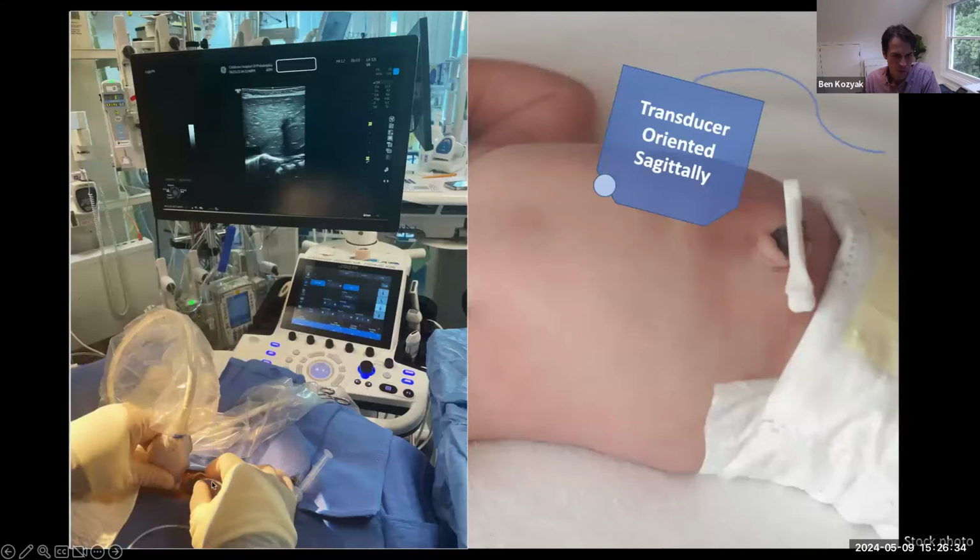So I basically drape the patient. I prep the patient essentially from hips to nipples and from one anterior axillary line to the other, and make a wide sterile field and drape it with towels. I make a little tent over the head so they can breathe, and so that the nurse can get in there with a pacifier and sweeties and whatnot, and then just set up the console so that what you're seeing on the screen matches what you're doing with your hands.